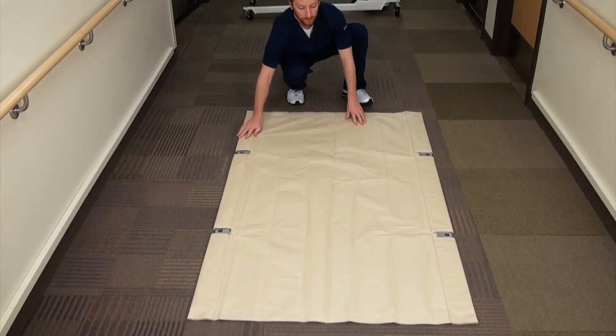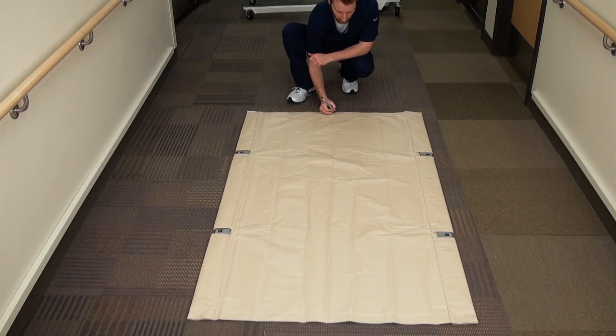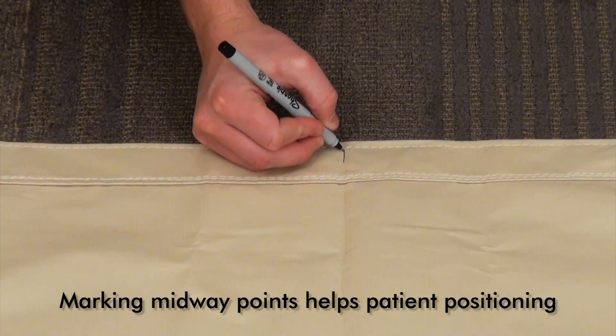Place the stretcher on a flat surface and unroll it. Take a pin or marker and mark the midpoint on the stretcher. This makes it easier to position the patient quickly and accurately during the weighing process.